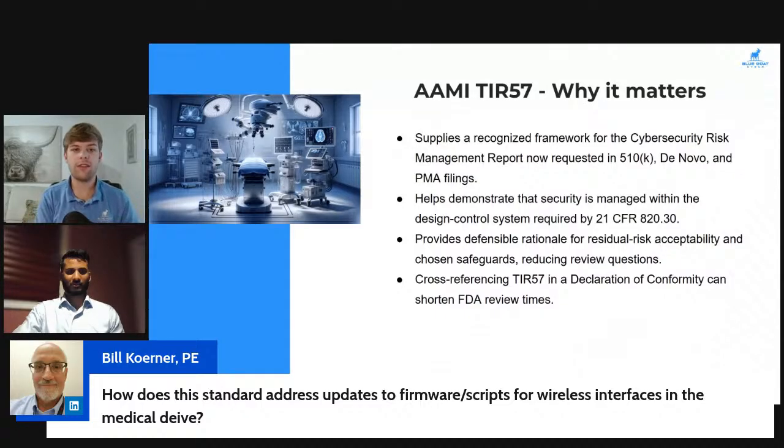If it's a wireless interface, we're assuming it's going to be an over-the-air update. What risks could be against the update infrastructure if you're hosting this in a cloud service provider, or if healthcare delivery organizations are supposed to have a centralized on-premise location for delivering out these updates? It is, again, going to be a risk-based approach. So it depends on what the actual update process is and just assessing the individual vulnerabilities.